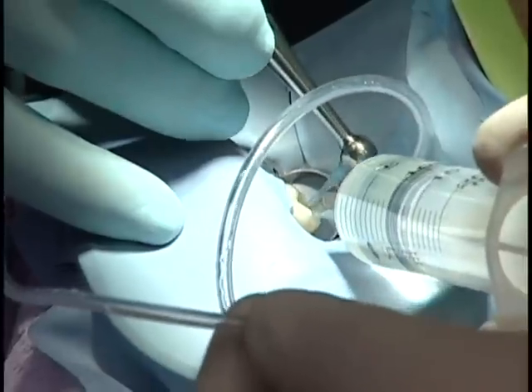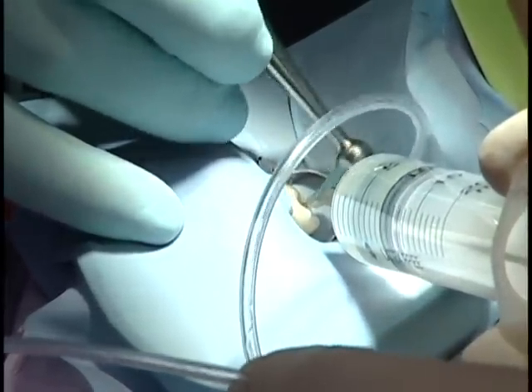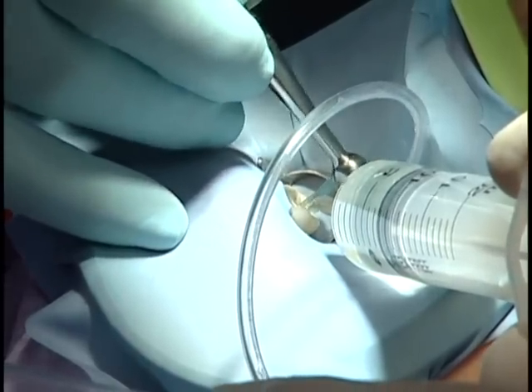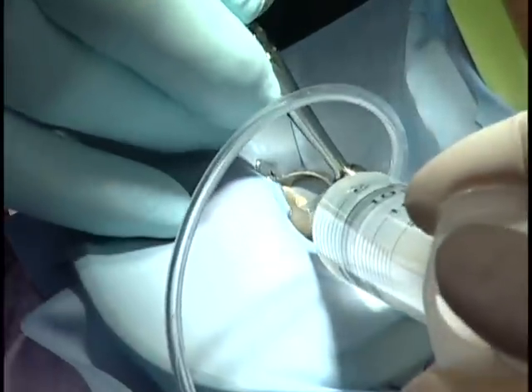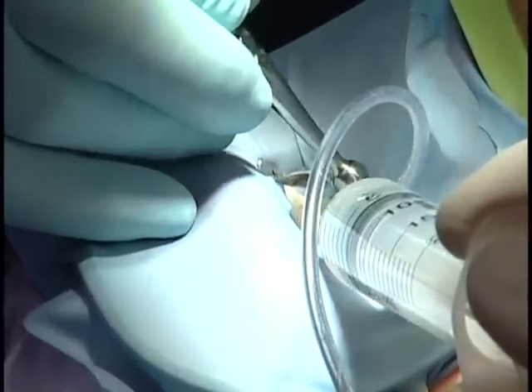As I am moving the macro cannula in the canal and Jennifer simultaneously irrigates up top, the irrigant being delivered by Jennifer is being drawn down the canal by the macro cannula, and it, along with coarse debris, is being evacuated up into the macro cannula and out the evacuation system.